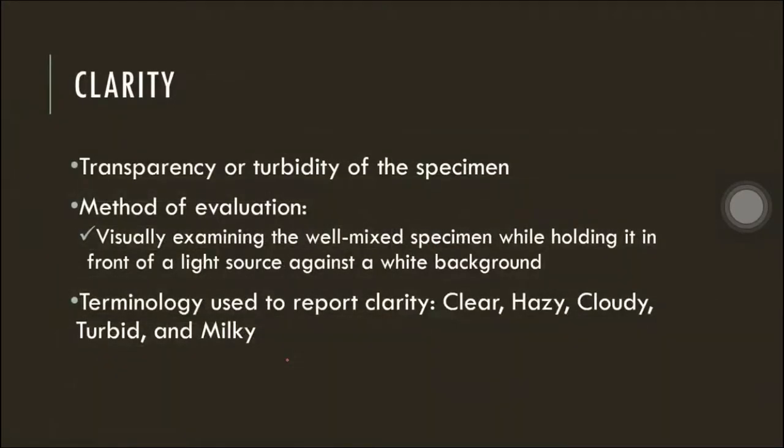How about for clarity? So clarity, transparency, or turbidity of the specimen. So how will you evaluate the clarity of the specimen? So just like the way the ancient physicians used. Okay, so visual examination of a well-mixed specimen. So take note, well-mixed dapat yung specimen before evaluating the clarity. So well-mixed specimen, holding it in front of a good light source against a white background. So what are the terminology used to report clarity? Okay, clear, hazy, cloudy, turbid, and milky. So again, take note, dapat yung specimen well-mixed.